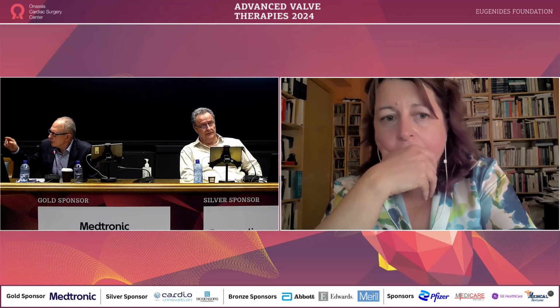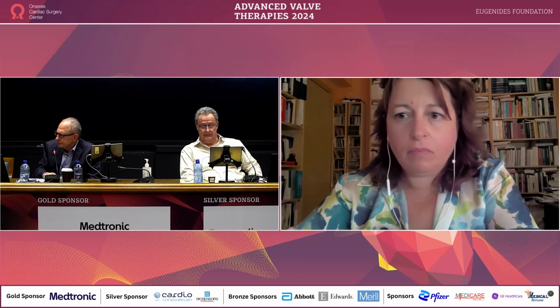The example that you showed clearly shows a leak that was coming down and then became horizontal, and that's very difficult when you try to position the device. Sometimes you will not close the leak, and you have this perpendicularity. We have Dr. Nyktari next to us. I think she can complete the answer.